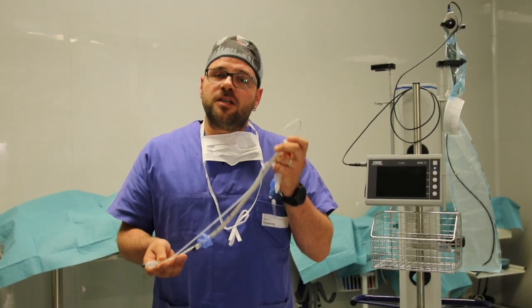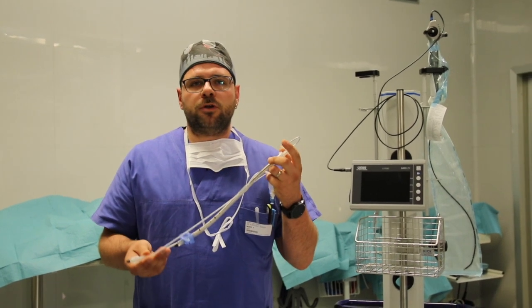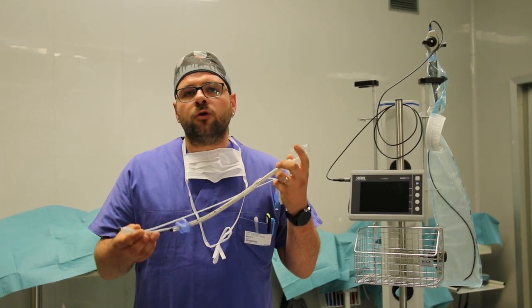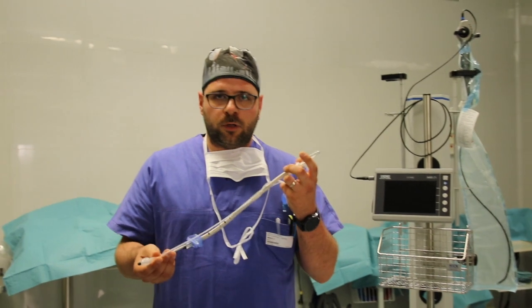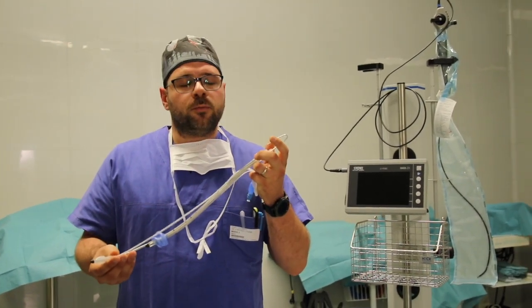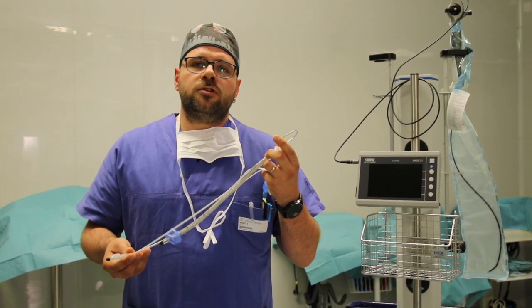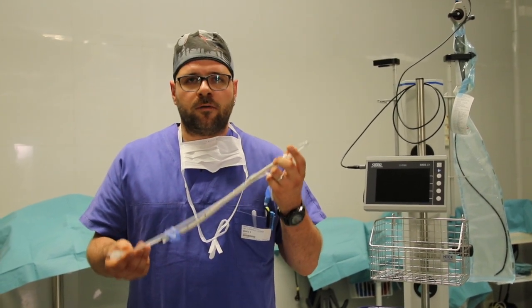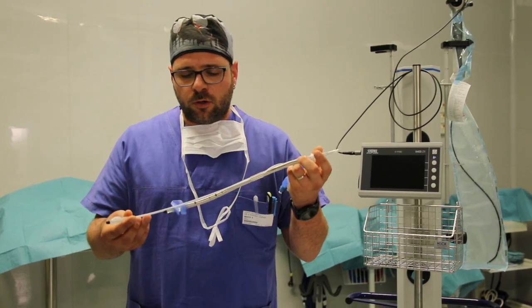SpritzTube is a supraglottic airway management device and as such it can be used even by non-medical staff. Most importantly, it can be used in case of critically difficult airway, in patients with limited mouth opening and in patients that have to maintain a neutral neck position with no hyperextension. Also, it can be used in emergency out-of-hospital settings, in patients that cannot be stretched supine contrary to a hospital setting, such as an operating room or intensive care unit.